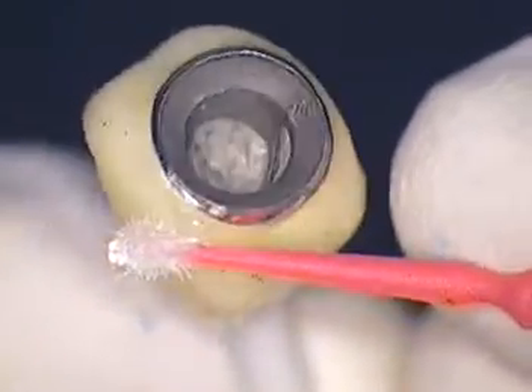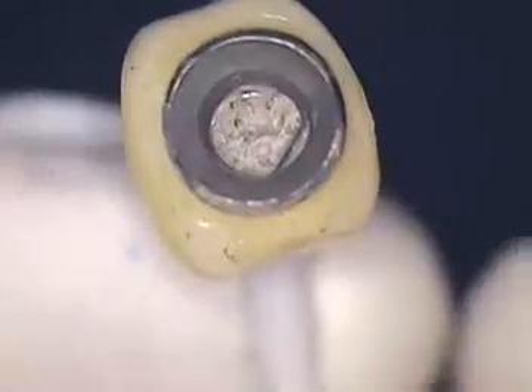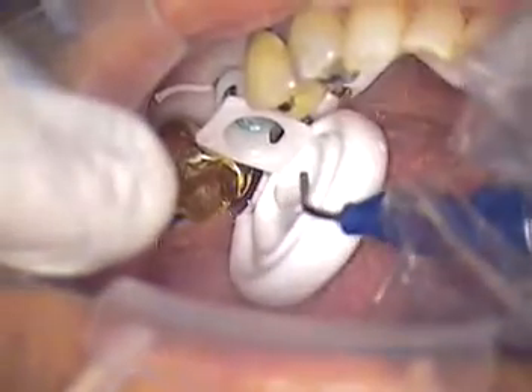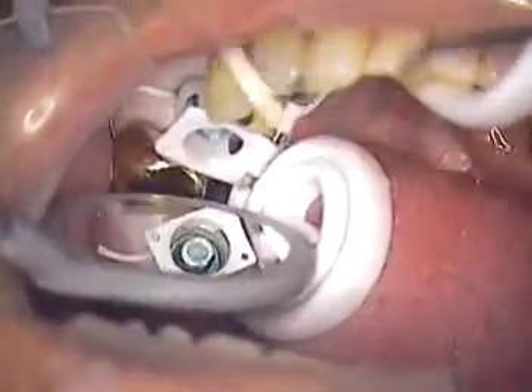We're going to use a cement called Reliax Cement — it is a composite cement. I'm not going to go through the chemistry since we've got to get all this in our video. Let me show you in the mouth what's going on. We packed our cord and left a little buccal tail out to the side so that we can grab hold of it after we cement the crown. We're going to be able to pull our Siltrax out — Siltrax is underneath. There's our impression coping that's pushing the tissue down just a little bit further.